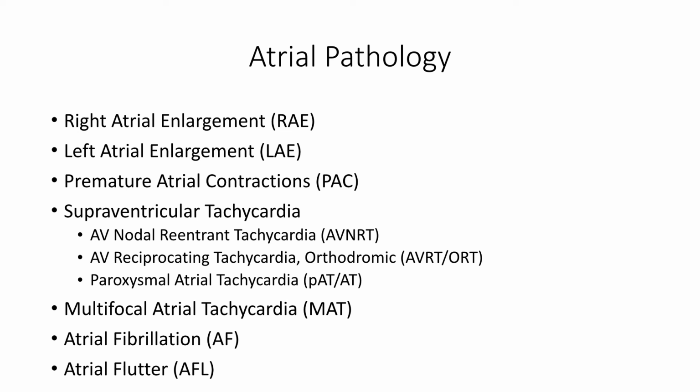in this umbrella diagnosis. So AV nodal reentrant tachycardia, AV-NRT, AV reciprocating tachycardia in the orthodromic direction, AV-RT, and paroxysmal atrial tachycardia, or AT. We'll next go over irregular rhythms like multifocal atrial tachycardia and atrial fibrillation, and then we'll finish with the classic atrial arrhythmia, atrial flutter.